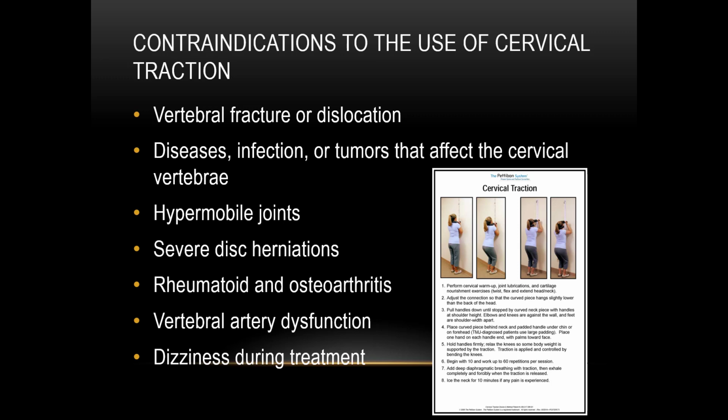Contraindications for the use of cervical traction. Contraindications associated with spinal traction include vertebral fracture or dislocation, disease, infection, or tumors that affect the cervical vertebrae, hypermobile joints, severe disc herniations, rheumatoid and osteoarthritis, vertebral artery dysfunction, and dizziness during treatment.